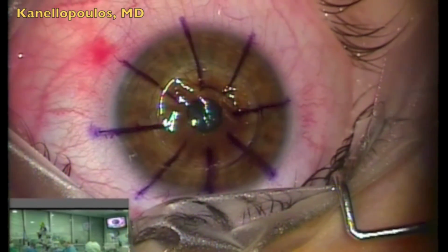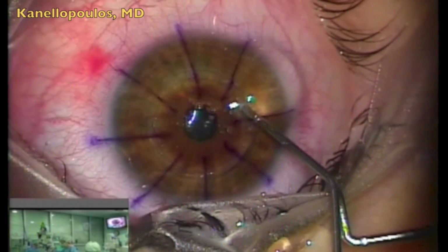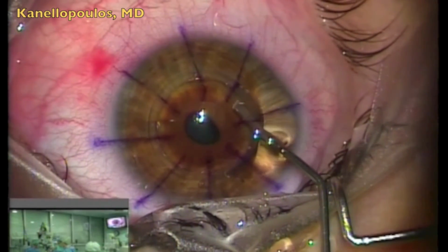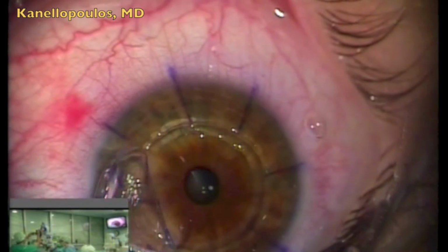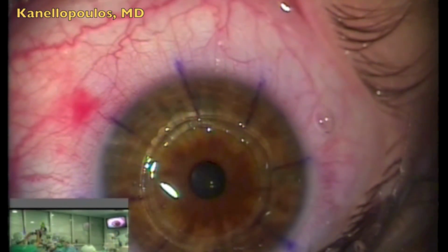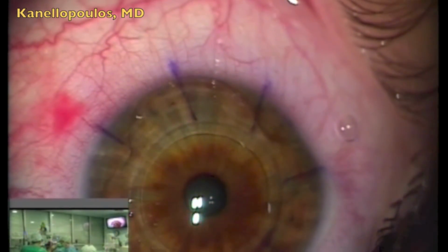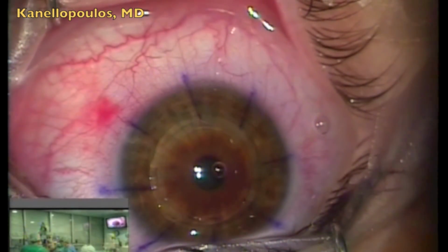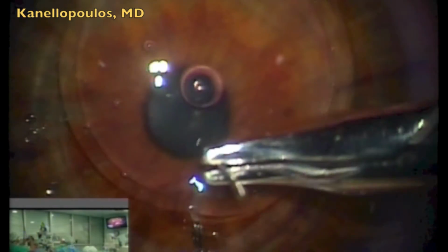Back to the host, the 8 radial marks, viscoelastic in the anterior chamber. We had given pilocarpine to attain miosis. We're filling the anterior chamber, and here again we're going to peel off the perfectly trephined cornea. We have the femto in our operating suite, methylcellulose gel again to fill the chamber. And we will bring in the donor button created as you saw before to place it onto the cornea defect and start our very careful suturing here.